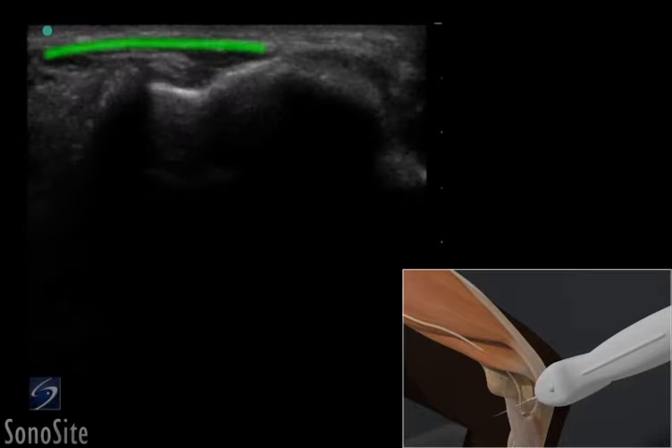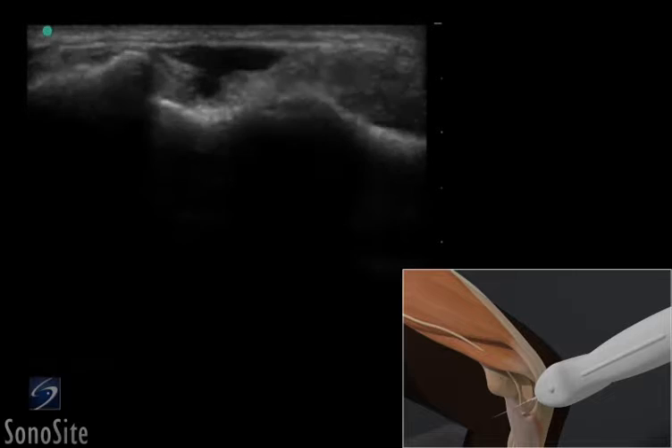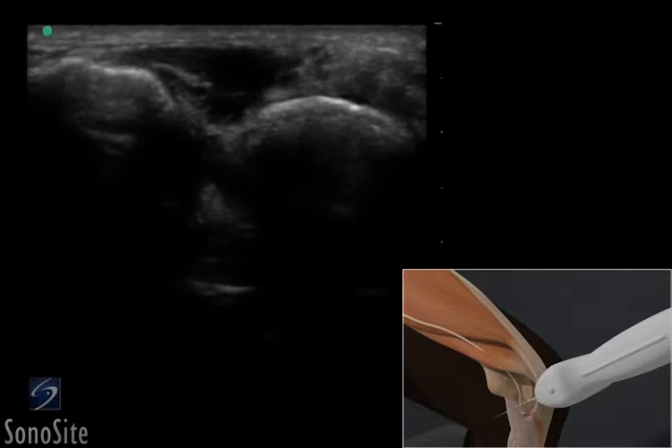The cubital tunnel retinaculum can be seen as a hyperechoic band-like structure that overlies the muscles and the ulnar nerve.